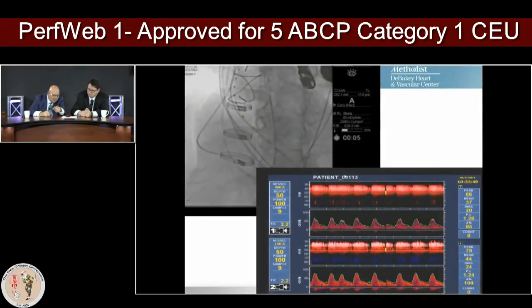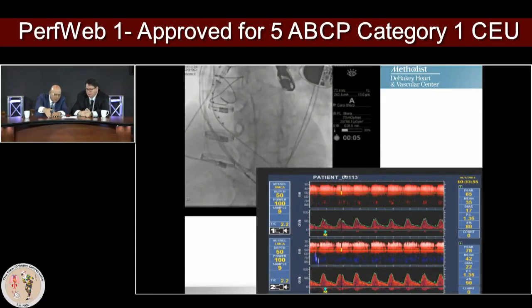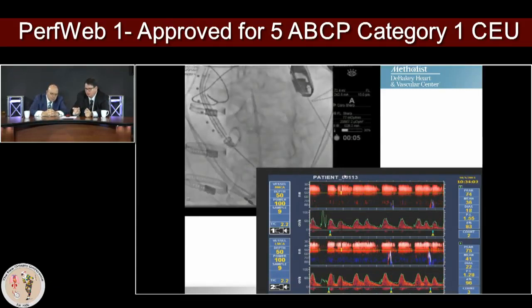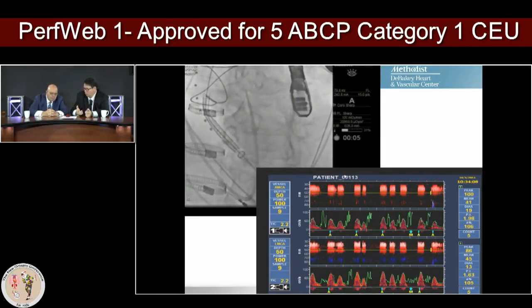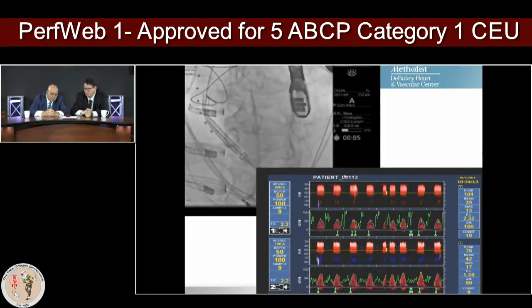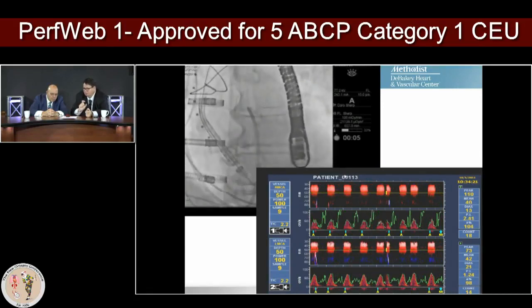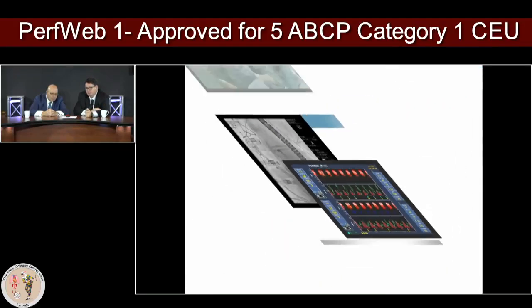So in that case, you've got good flow. Exactly. Because your diastolic pressure is not going to baseline or below. Exactly. So a good, nice, open valve area. And right now, watch when the valve is arriving into the aortic valve. See how the diastolic flow just disappeared? Mm-hmm. So you're blocking your outflow tract. Sure, you're not going to see diastolic perfusion. You want to deploy it, so you want to help the perfusion in diastole. This is a short period of time. You want a faster deployment for sure, but this is just giving you a clue how the flow changes while you even have your TAVR in the aortic valve.